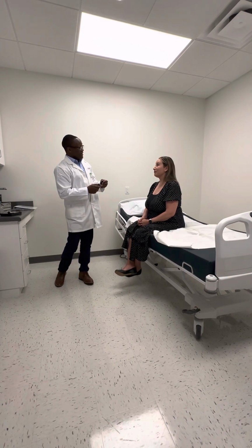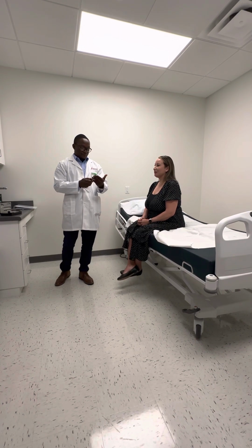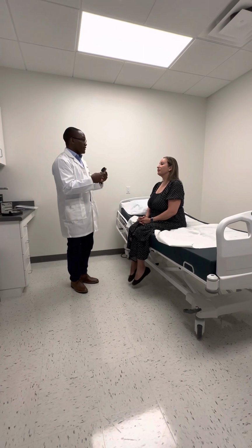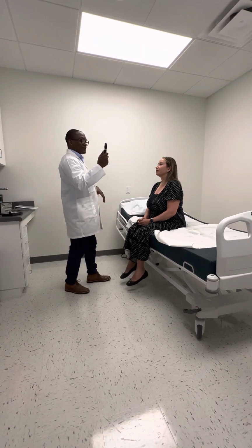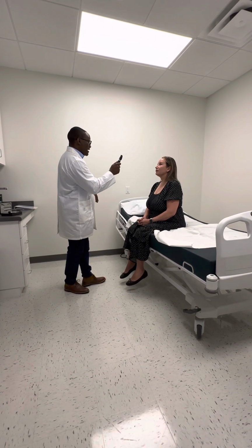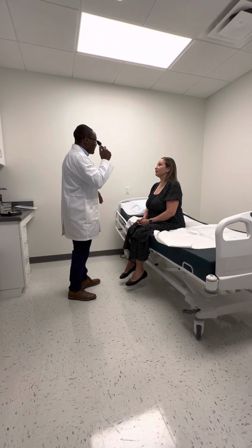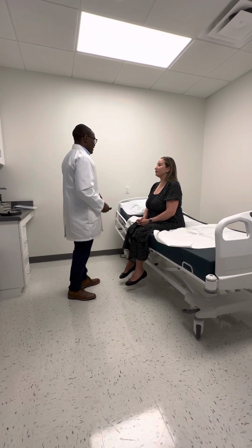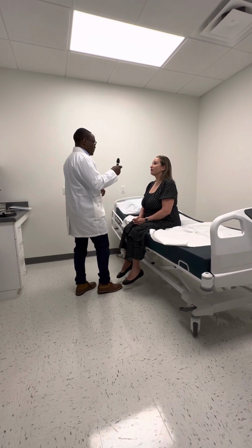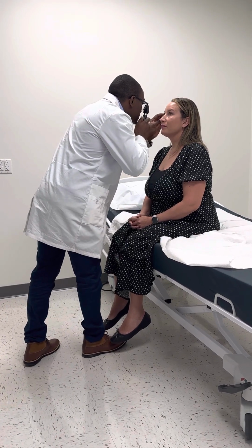I'm about to confuse the ear with the eyes. So the technique in observation with the fundoscope is that the right hand observes the right eye, okay? And I'm going to use my right eye for the right eye, okay? All right. So go ahead, let's see.